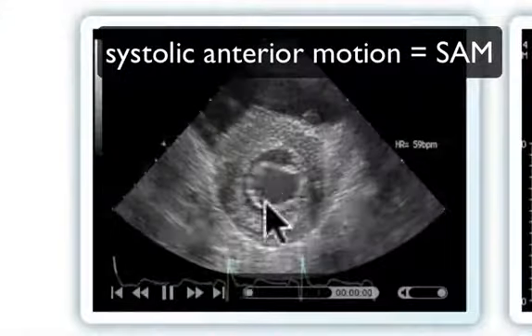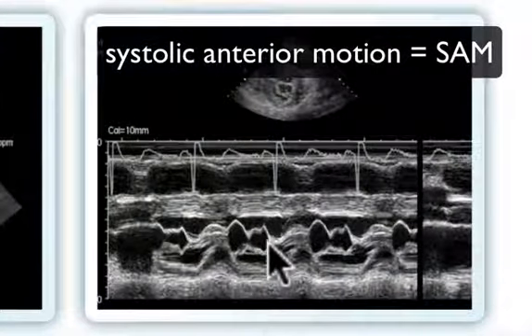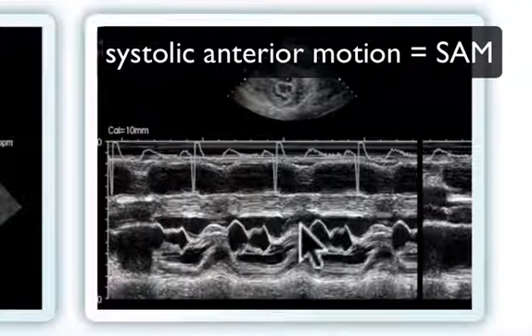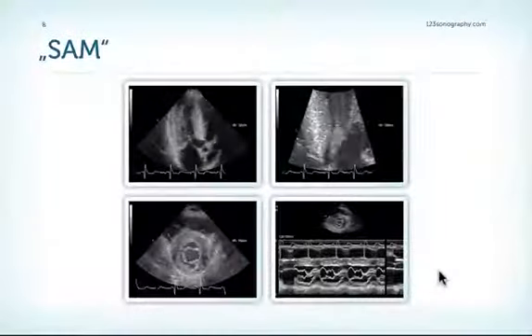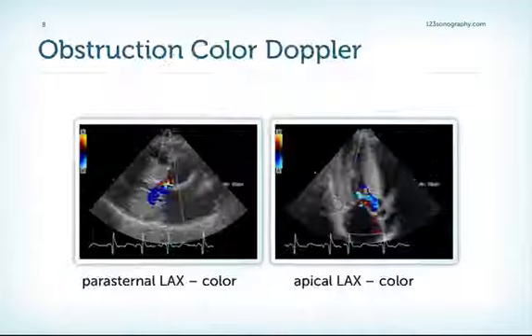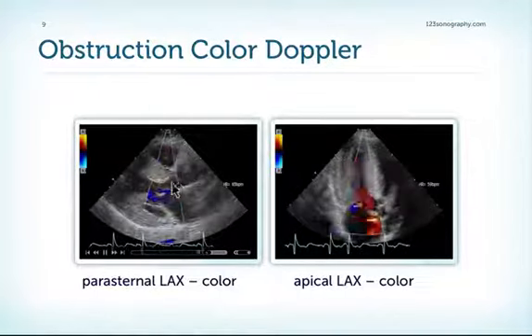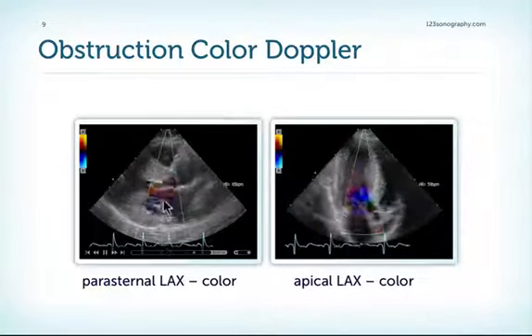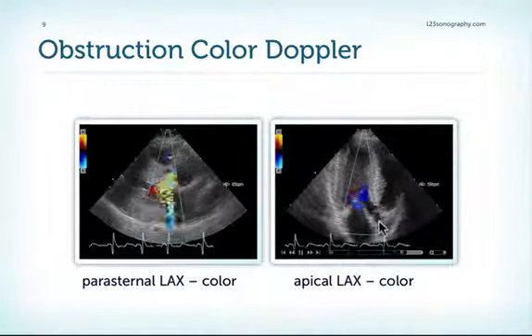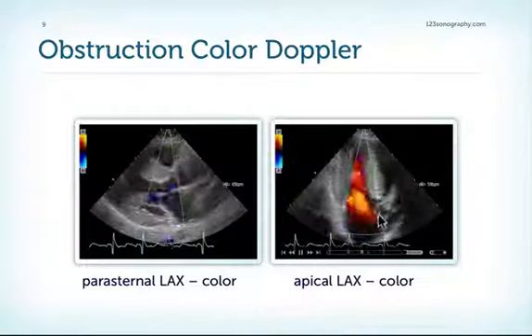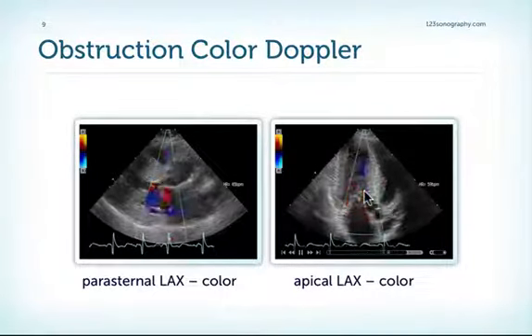SAM can also be seen in a short axis view and even in M-mode, where during systole we have motion of the anterior leaflet which obstructs the LVOT. Using color Doppler, we can visualize the obstruction: there is turbulent flow in the LVOT and even some mitral regurgitation. We'll talk about the importance of this form of mitral regurgitation later. In the apical long axis view, turbulent flow begins at the region of obstruction by the mitral valve.